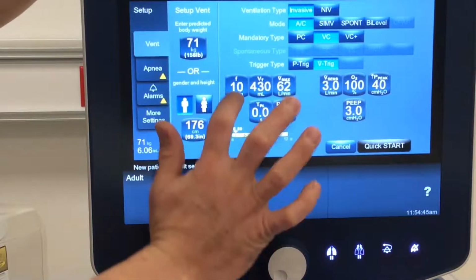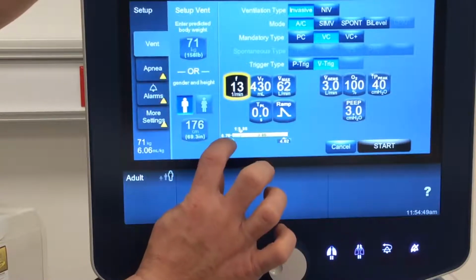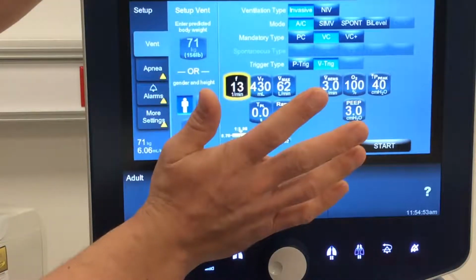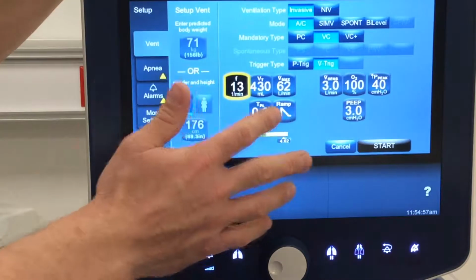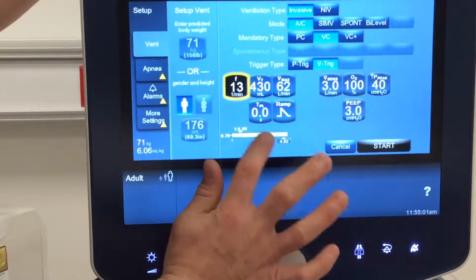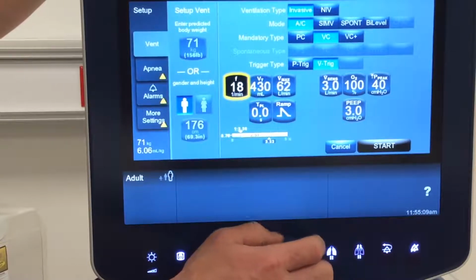So if inspiratory time is fixed, as I start making changes to the respiratory rate, you'll see that inspiratory time stays fixed. What happens is my cycle time gets smaller. Remember, cycle time is the total amount of time for inspiration and expiration to take place. Okay, so if my I time's fixed and my cycle time's getting smaller, we see what takes place. Well, your expiratory time is what gets robbed. So we've got to keep that in mind. We'll do a couple of exercises with that here shortly.